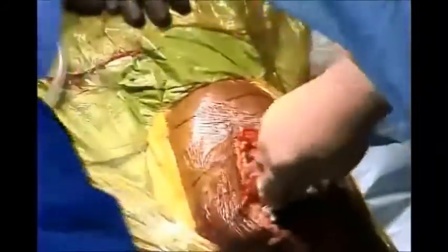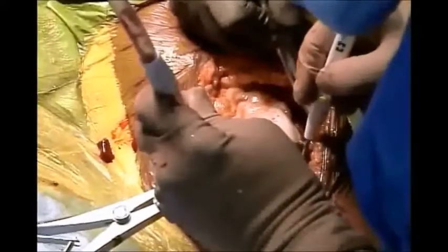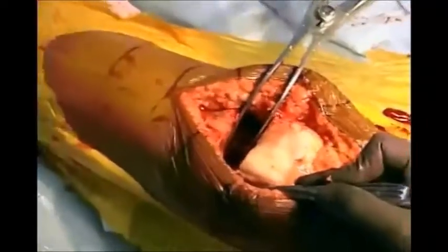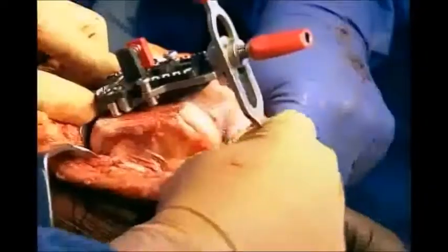You put a spacer block after you cut the tibia and the distal femur, and test for soft tissue stability in extension. In the valgus knee, I relieve the posterior cruciate ligament and posterior capsule in extension at the level of the tibial cut surface, then with a knife I do pie crusting of the IT band. After you've done the release, the knee should open in extension equal amounts both laterally and medially — about two to three millimeters.